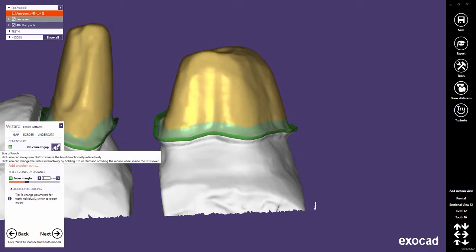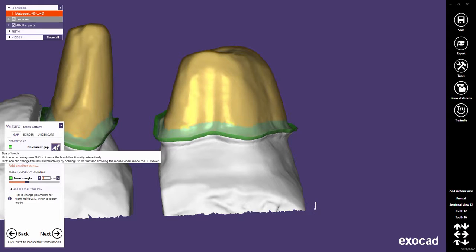Furthermore, both zones can be defined with a brush. Click on the brush button for the zone you want to adjust. Let's try it with the no cement gap zone.